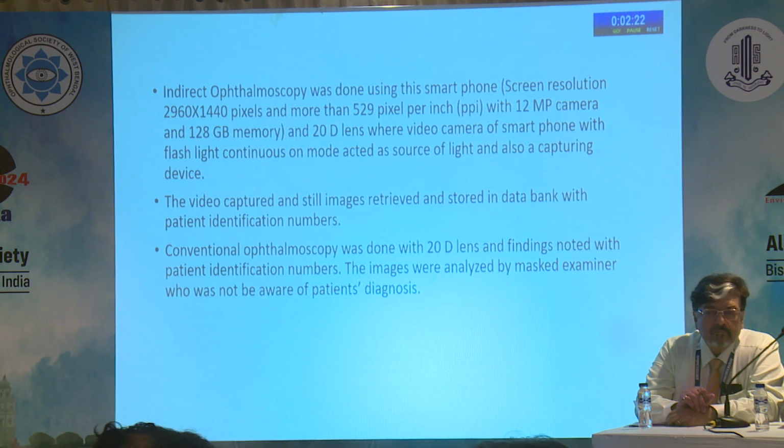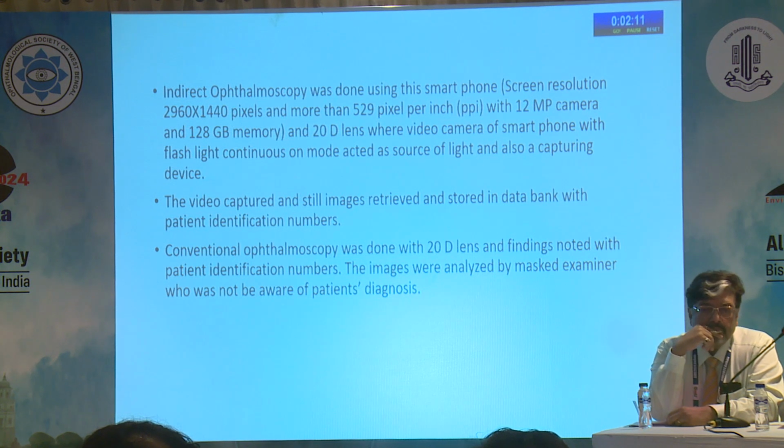Ophthalmoscopy was done using the smartphone and the 20 diopter lens, and indirect ophthalmoscopy. The videos were captured and stored in a data bank, and conventional ophthalmoscopy was also done with a 20 diopter lens.